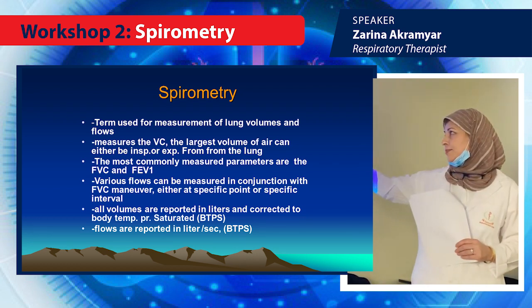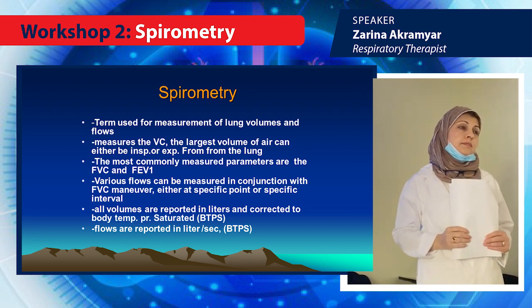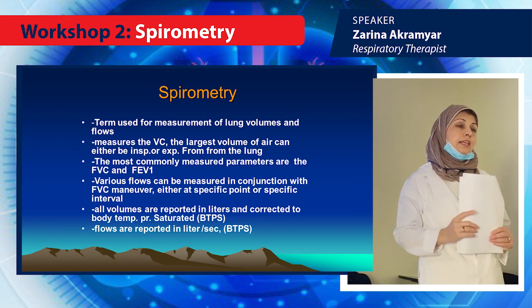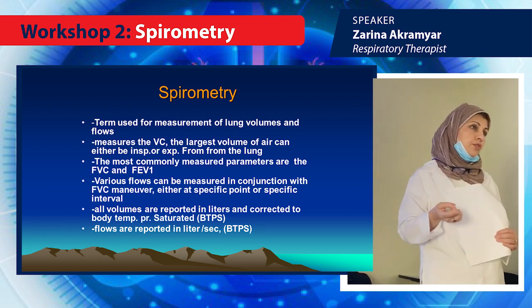VC stands for vital capacity. But here we call it FVC. Why is it FVC? Forced vital capacity. Exactly, force. We are measuring it forcefully. I will explain why we are measuring it forcefully.